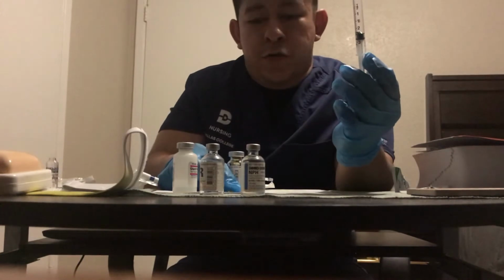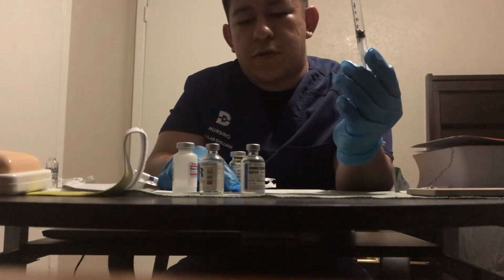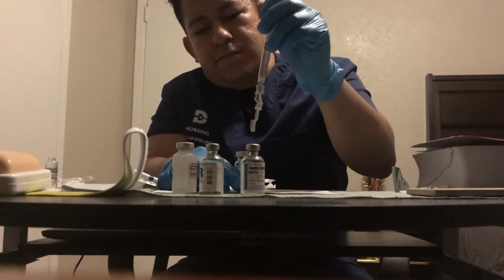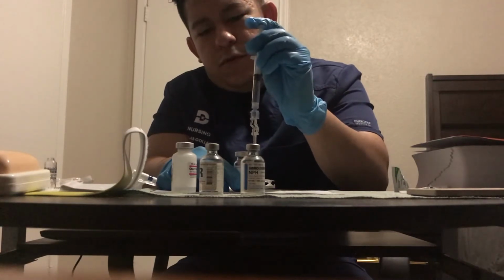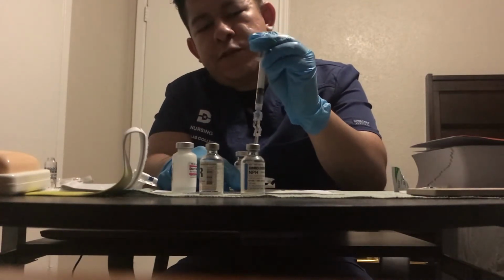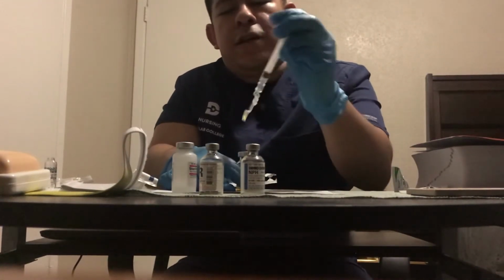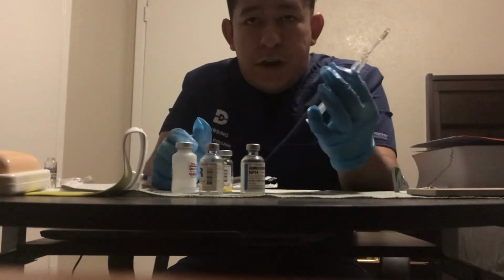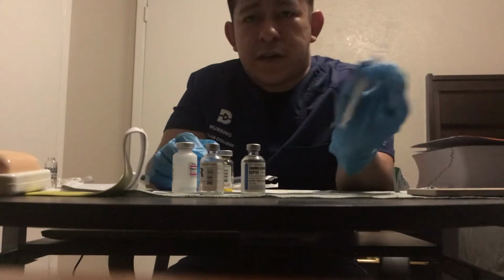we are going to inject the sterile water into our ceftriaxone. So we inject our 2.5 mLs of sterile water into ceftriaxone, and then you remove the needle, and you could put the safety on immediately after and dispose of it, but get a new needle.